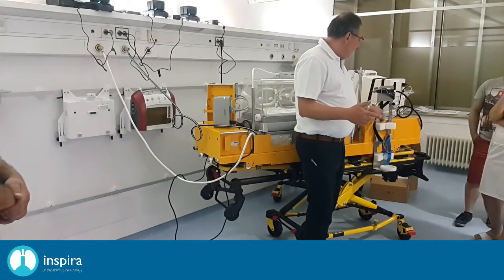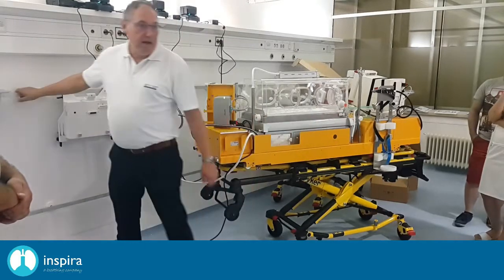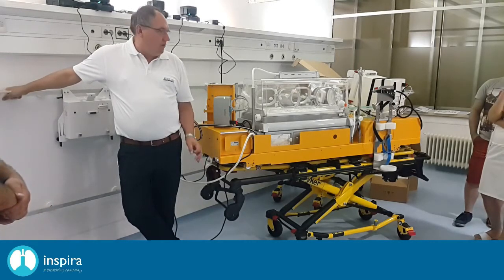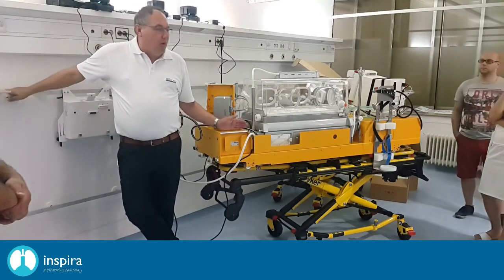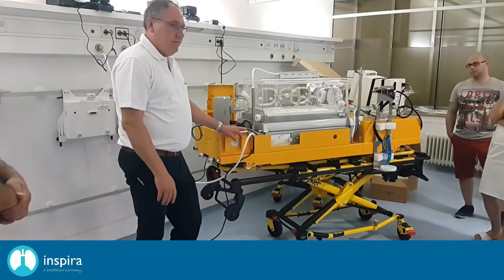In these cases, all these systems are also possible to connect to a wall rail, okay? And they have to be adapted inside the car as well as in the helicopter to the rail system. Don't leave it on the incubator, okay? The incubator bracket is only for the transport intra-hospital, okay?